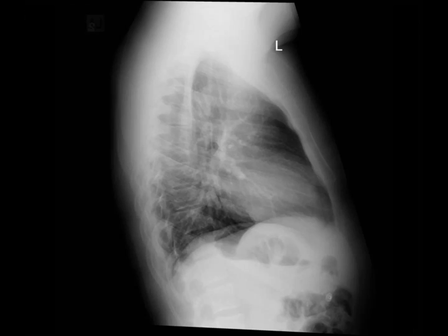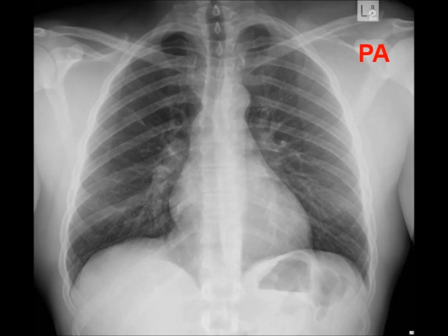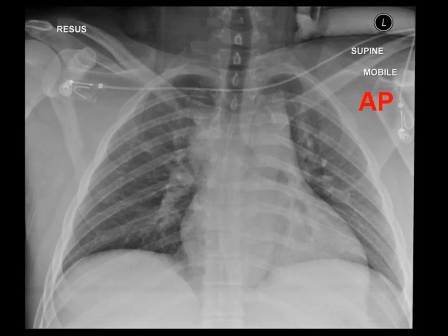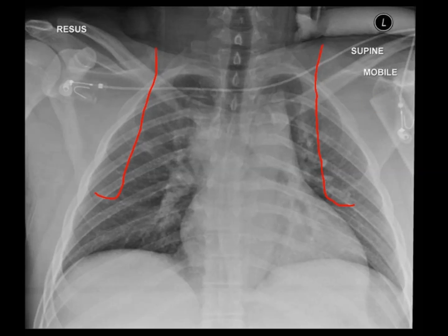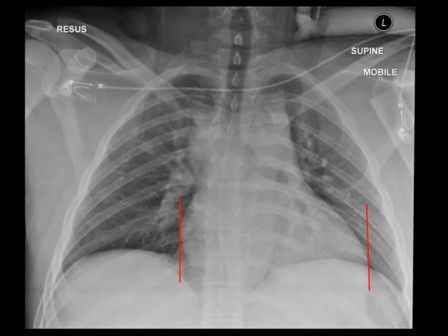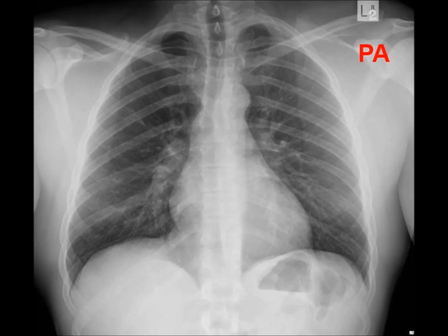Step two: check the type of film. Often you will be told the type of film, but if not, there are clues you can look for. First, you want to know from which direction the x-ray was taken — PA, AP or lateral. While a lateral film is easy to spot, differentiating between an AP and a PA requires a bit of Sherlock Holmes clue hunting. Look at the clavicles and scapular edges on this PA film, then compare with the AP. In the AP projection, the borders of the scapulae are sharp and appear to lie over everything else, while the clavicles appear obscured by the ribs. Also notice that the heart appears abnormally wide. You also want to know the patient's position — upright or lying. In an upright patient you might see a fluid level in the stomach.